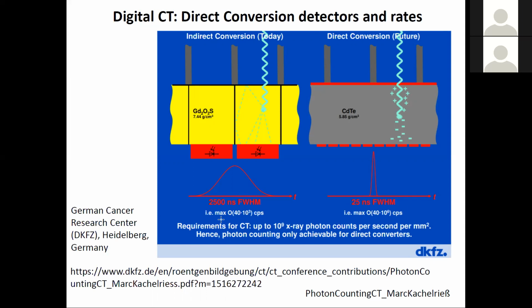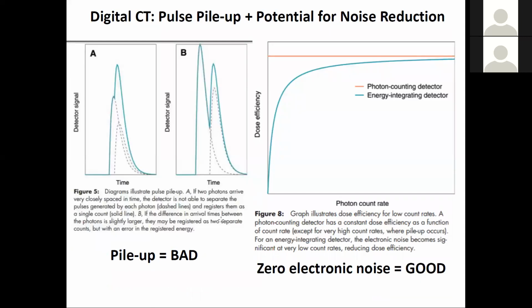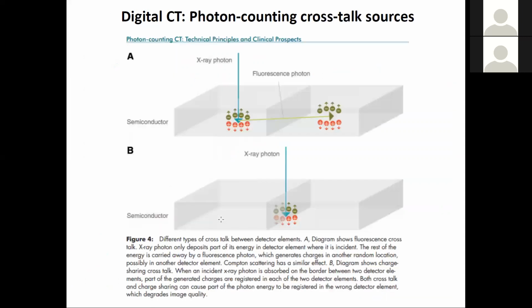But here's where we stand at the moment, or close to the moment, for direct conversion, single photon counting. Direct conversion you can have anyway without having single photon counting, but we'll talk about it in the case where you do have single photon counting. So you worry about pileup, where you have two events at the same time. You're trying to measure your photon counting rate, and you make an error when you do that. You also have crosstalk, which is unpleasant. So all these real world effects need to be built into your system response model. And here we are hand tuning again.